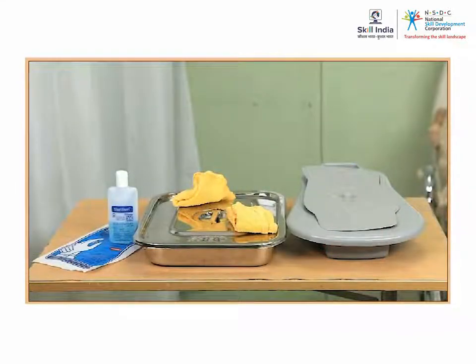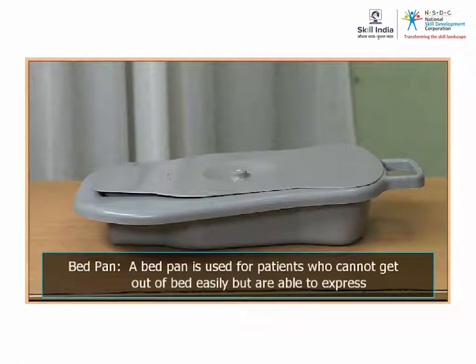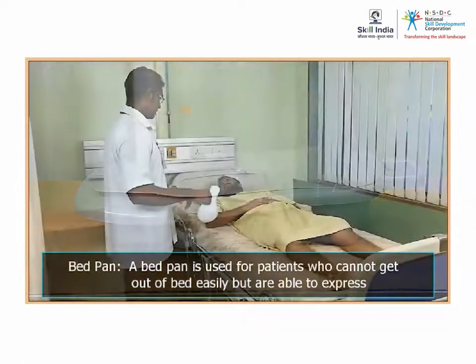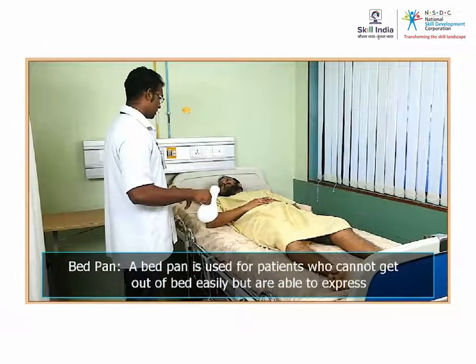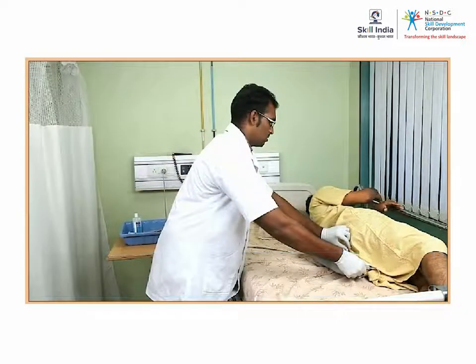For patients who are confined to the bed, different types of equipment can be used to manage the elimination needs of patients. Some of the equipment used are: a bedpan is used for patients who cannot get out of bed easily, but are able to express their need to pass urine or defecate. The bedpan is placed underneath the patient who can urinate or defecate as needed.